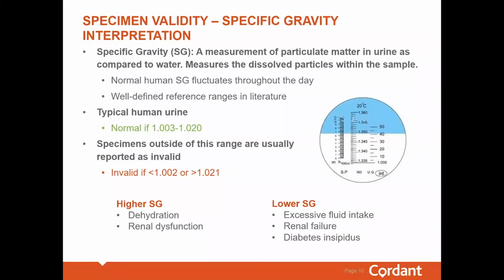Often, clients choose to only measure specific gravity if the creatinine of the sample is considered dilute. They would use this as a secondary marker to confirm dilution, which we will speak more on in the next slides.